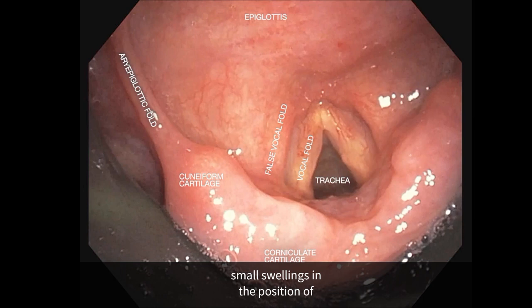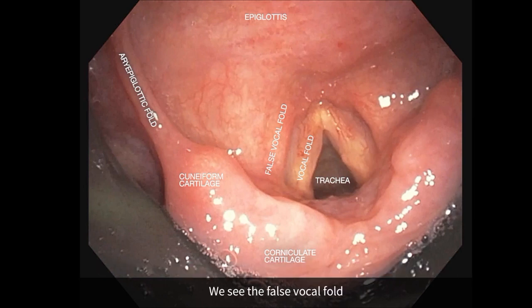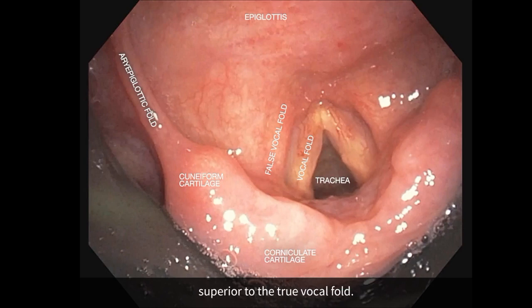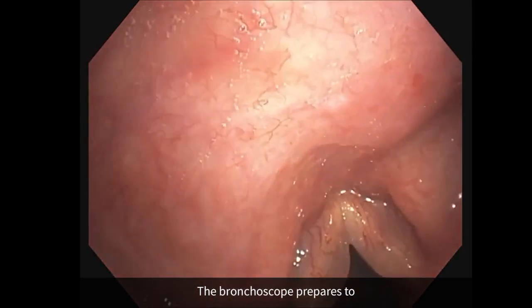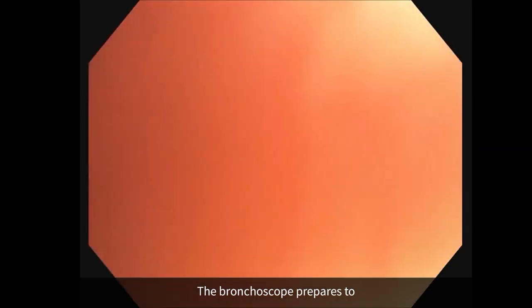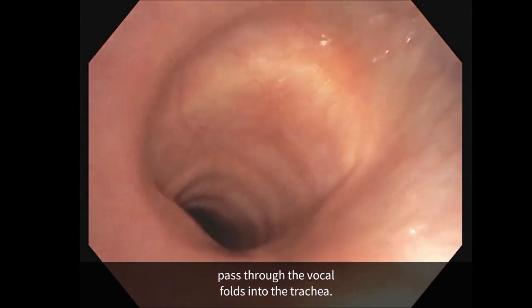We see the false vocal fold superior to the true vocal fold. The bronchoscope prepares to pass through the vocal folds into the trachea.